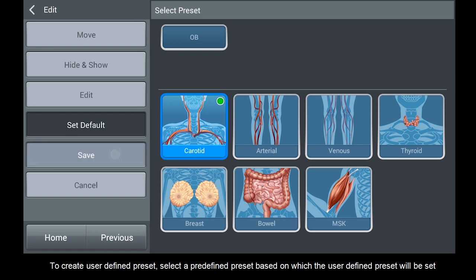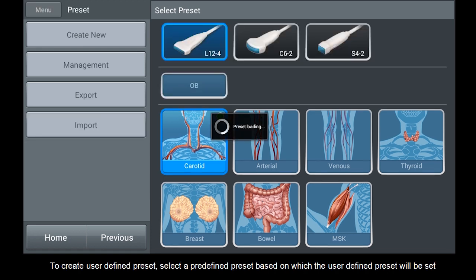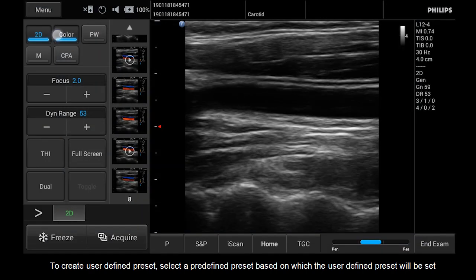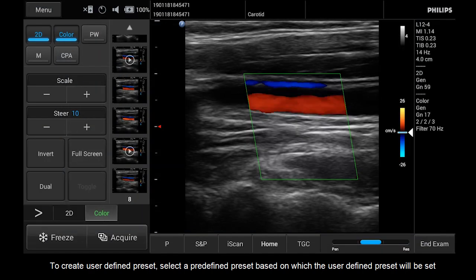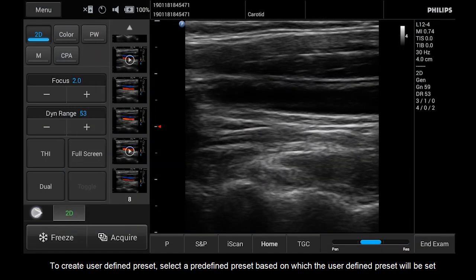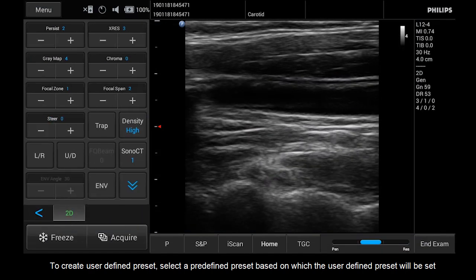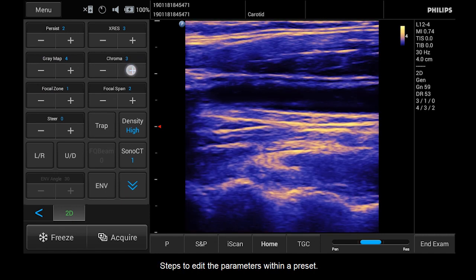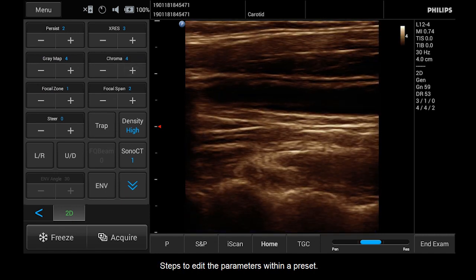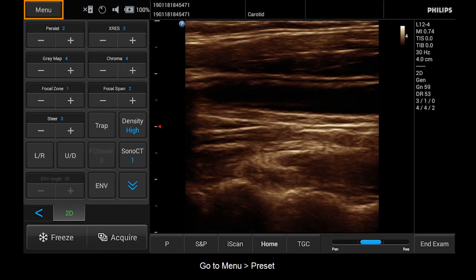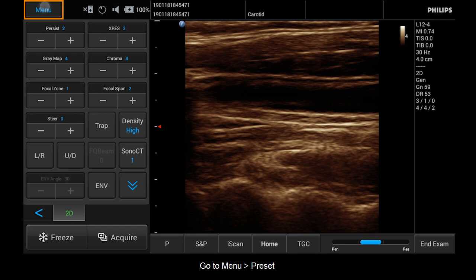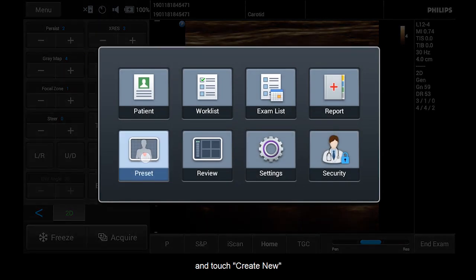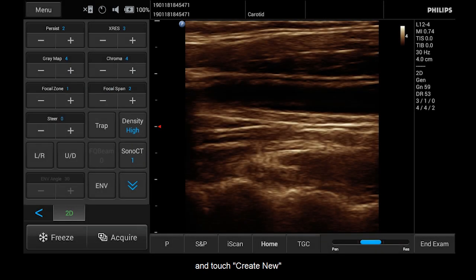To create a user-defined preset, select a predefined preset based on which the user-defined preset will be set. Follow the steps to edit the parameters within a preset. Go to Menu, Preset, and touch Create New.